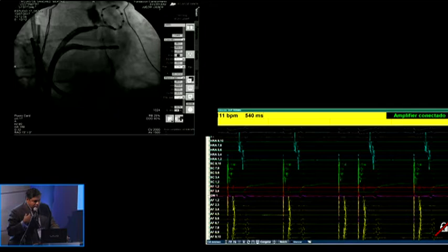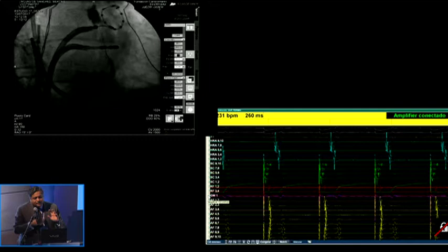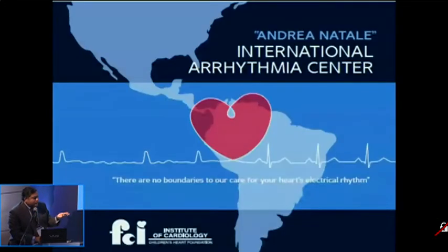Our strategy at UCLA has been to always do esophageal contrast placement, and then we, of course, observe it. It's very hard to interpret what the temperature really means in the esophagus because there isn't enough data. But we try to stay away from it if it's incredibly close. We try to see if we can use the esophageal probe, using a tighter probe, to move the esophagus away. But I do think that is a concern, and you have to be very careful about where you place it, because that entire area can become an ice block.